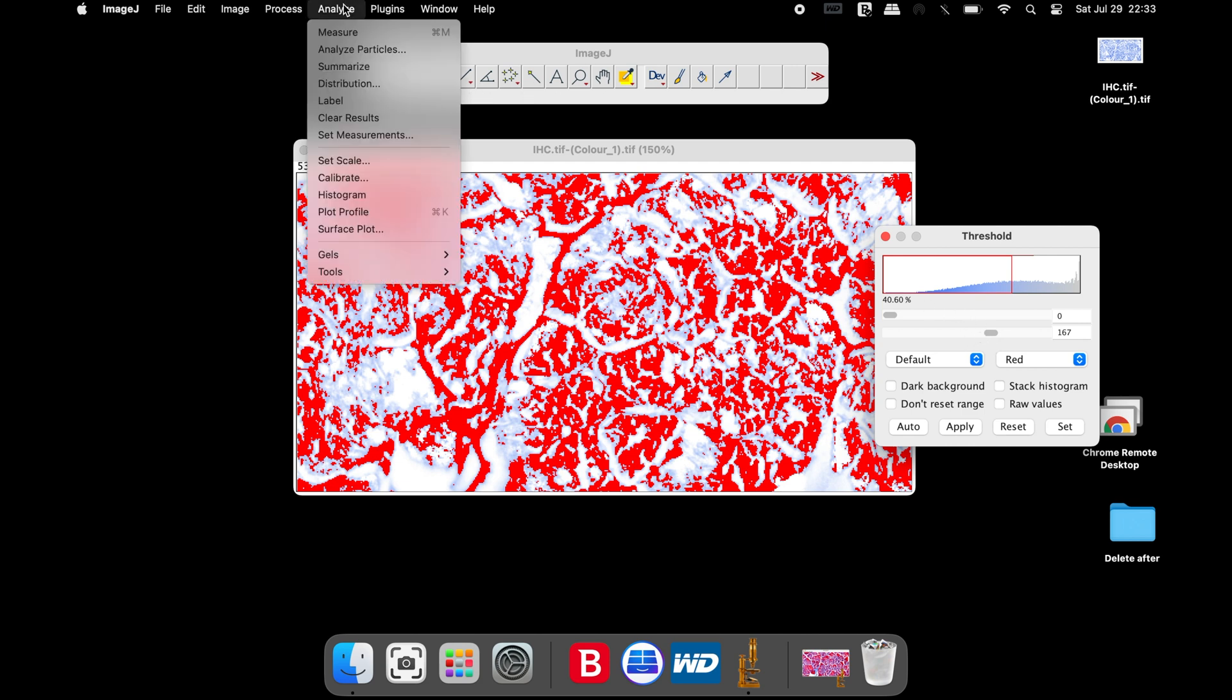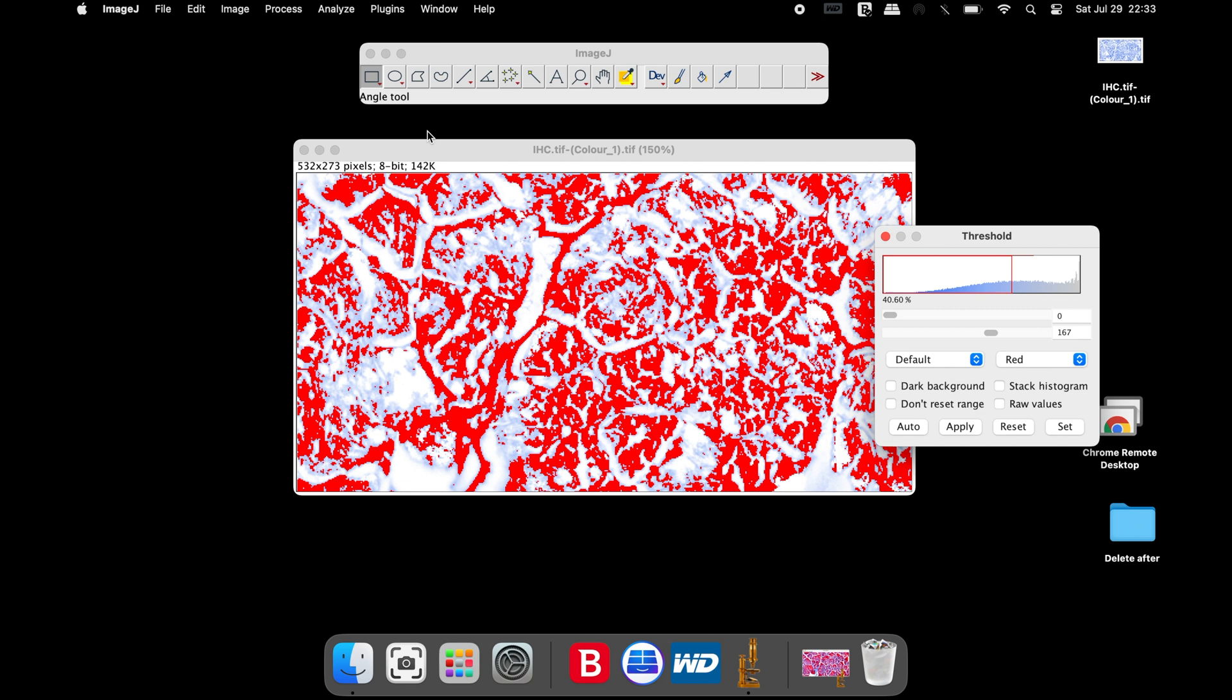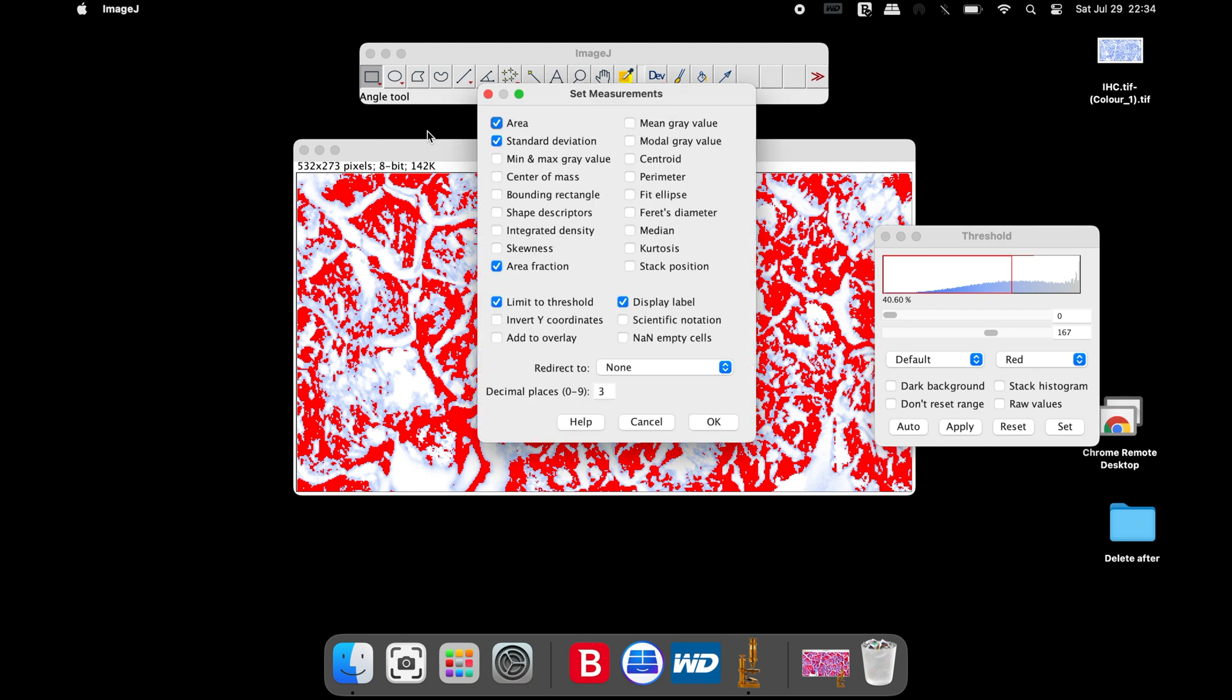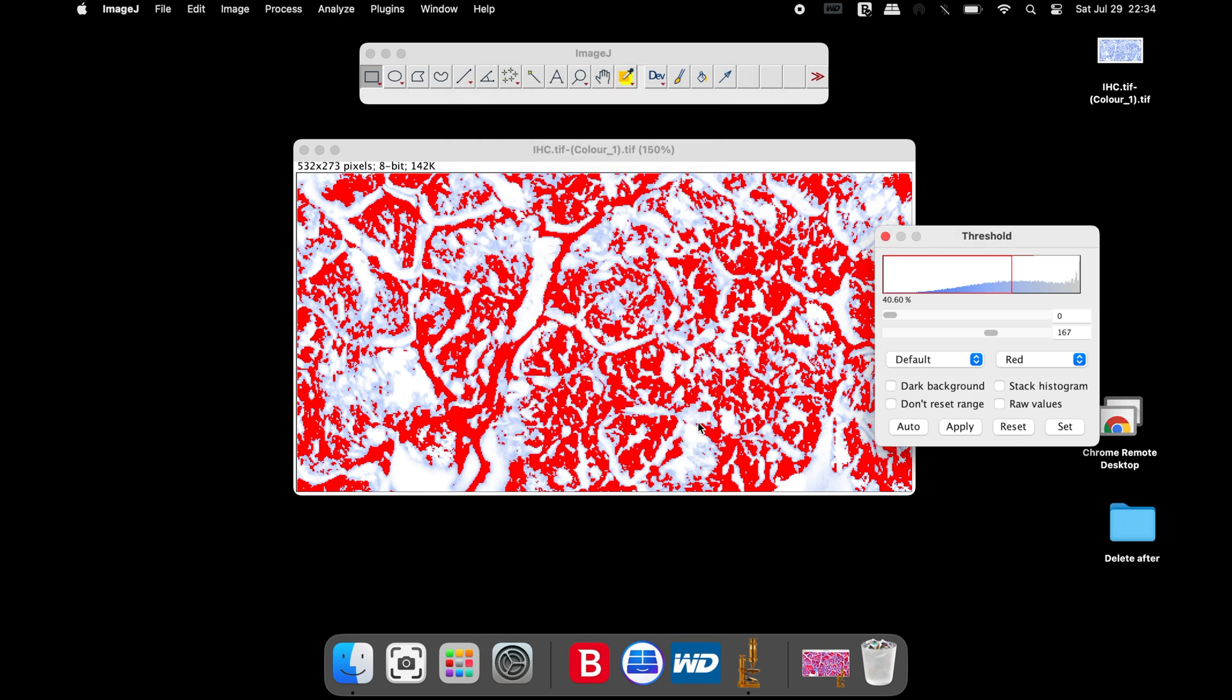head to Analyze and Set Measurements. In the Set Measurements window, select the Area, Standard Deviation, Area Fraction, Limit to Threshold, and Display Labels. Once completed, click OK.